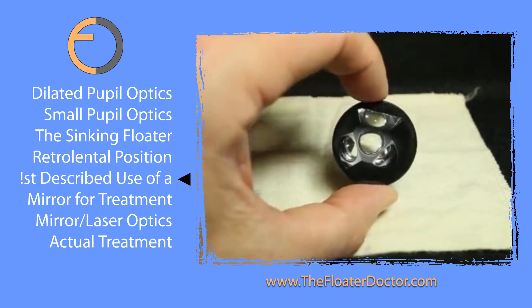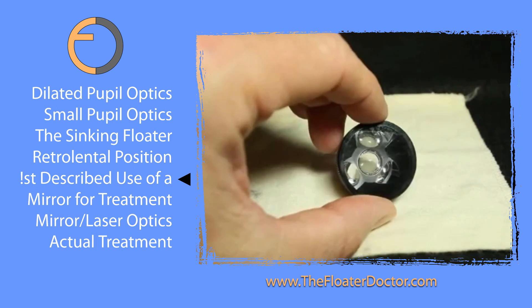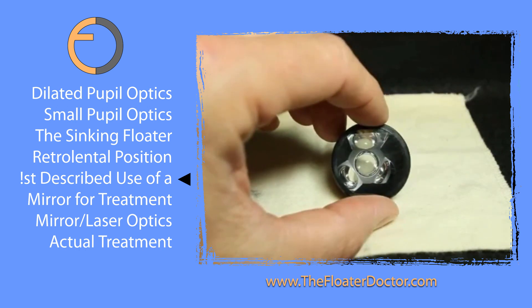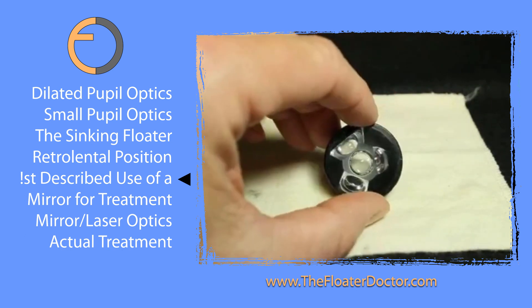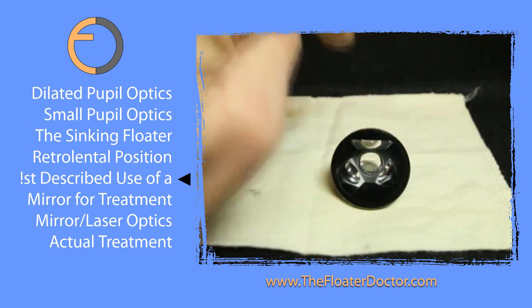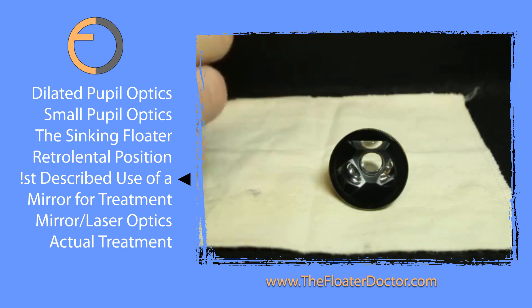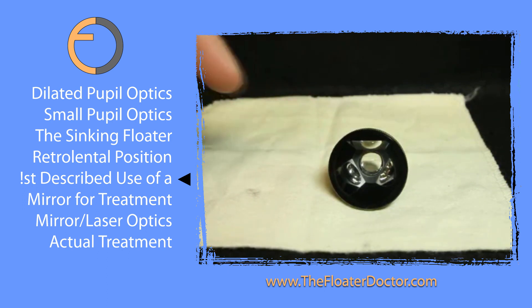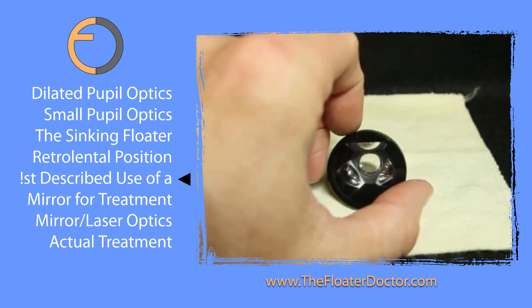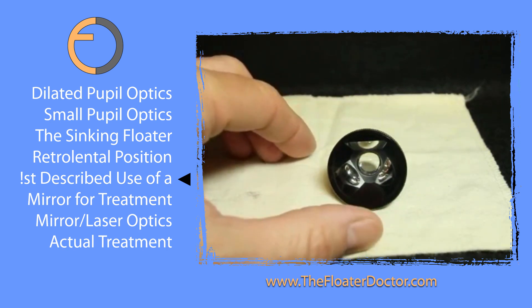What's unique about the Goldmann lens is that there is a central clear zone, but you can also appreciate three other images surrounding it — these are mirrors. The mirrors are at different angles and allow you to look into different areas way out into the periphery of the retina, and even as sharply angled as one mirror that allows you to look towards the recesses of the far reaches of the iris. In this video, I was able to use one of the mirrors to angle the laser down into the lower aspect of the eye to get a floater that would sweep up very close to the lens and then drop back down. As it dropped back down, it dropped a little further away from the lens and allowed for a shot. I believe this is the first time anybody has described using the mirrors with the YAG laser to treat floaters — a unique situation used with some great success.